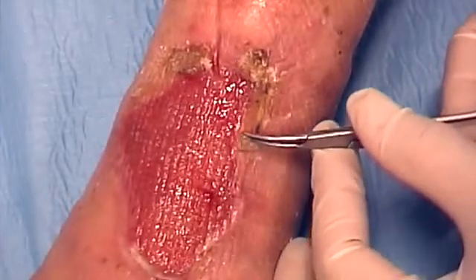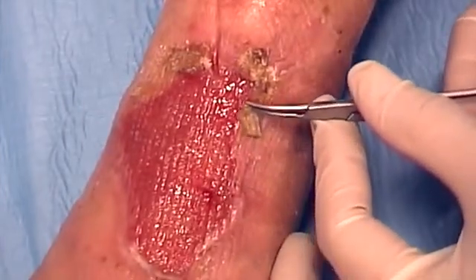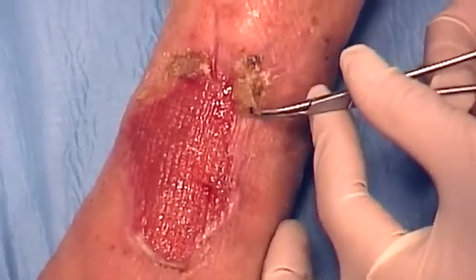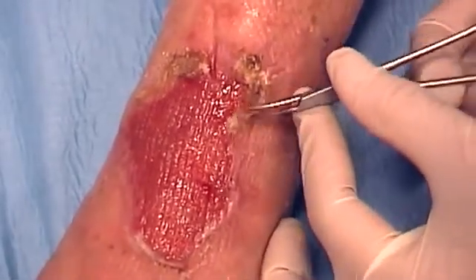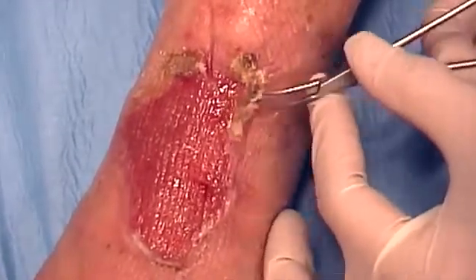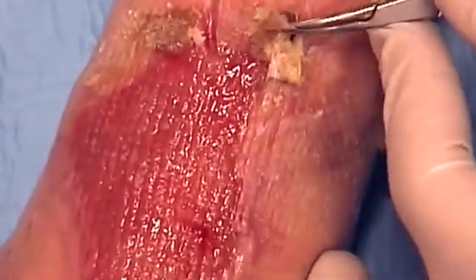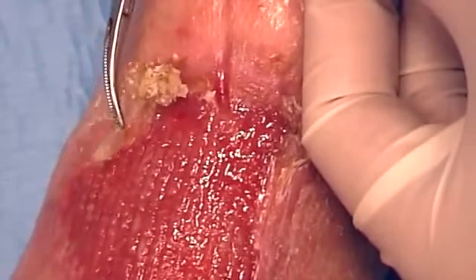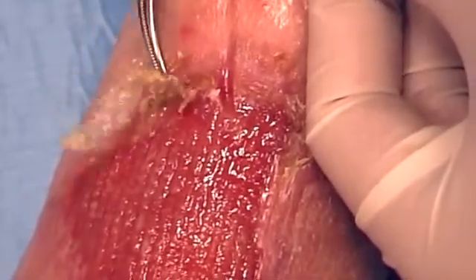In this case, we can see the removal of the Genix EGI membrane for epithelial growth 15 days after its application on the edge of the wound. Here the membrane is not reabsorbed, but facilitates replication and sliding of epithelial cells from the skin edges towards the center of the wound. This application is repeated every 10-15 days until complete closure of the wound.